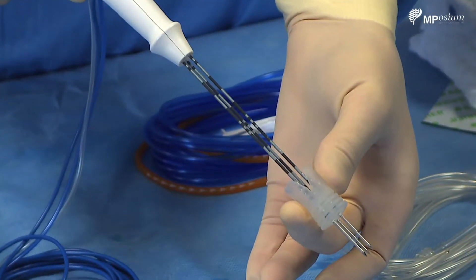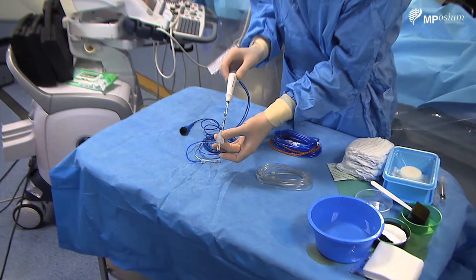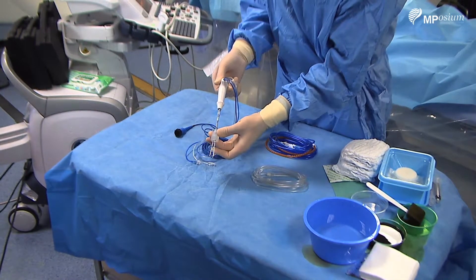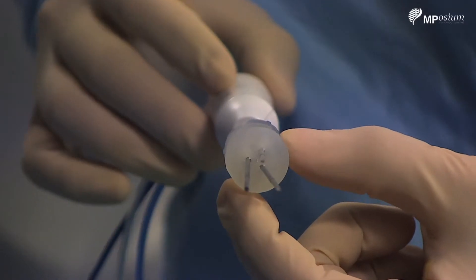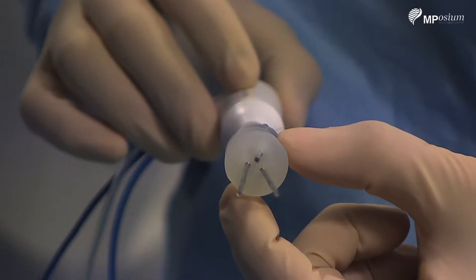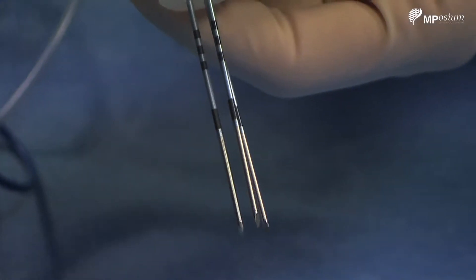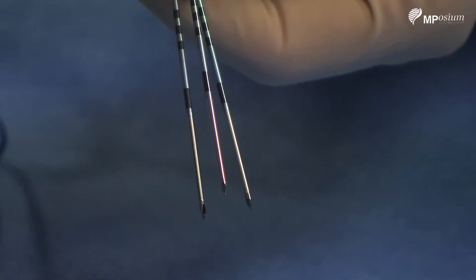When you are puncturing, you have to be very careful to push the needle but never to rotate it, otherwise you will have too much distance in between the probes. You have to remember to always stay in the same axis when pushing or retrieving the needle inside the patient.